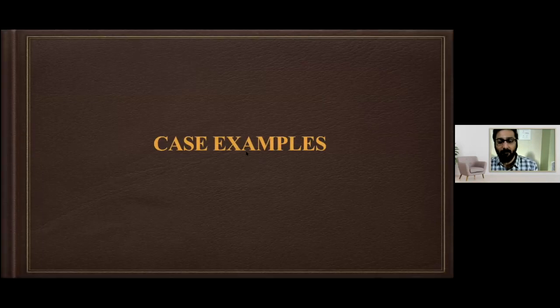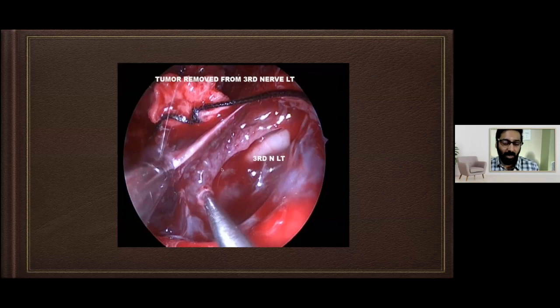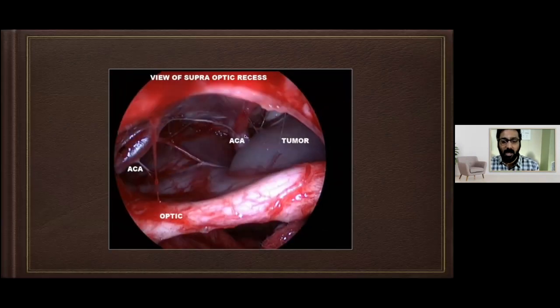And then you never try to pull that. There are two kinds of dissections, which I always say. One is a blunt and the second is a sharp dissection. Previously, we were actually doing the blunt, but now we have changed to sharp dissections, especially near the cranial nerves and the perforators. And then you can do all these, you can see how the optic chiasm is seen, and you can go just above to see the anterior circulation.